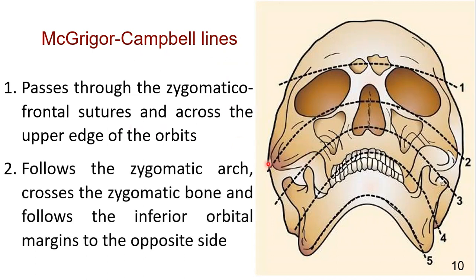The second line — here you can follow it — passes through the right zygomatic arch, right body of the zygoma, right infra-orbital margin, nasal complex, then left infra-orbital margin, left body of the zygoma, and left zygomatic arch.